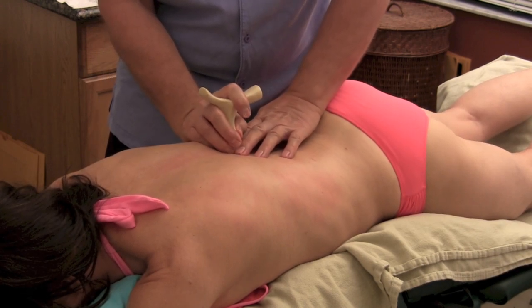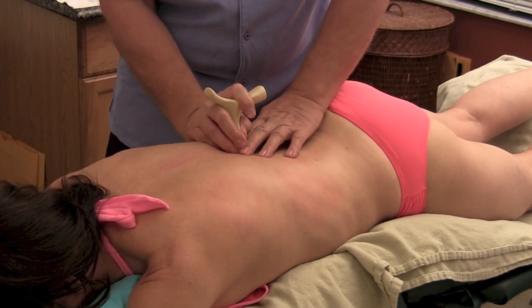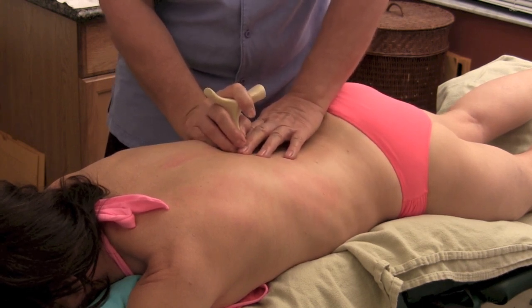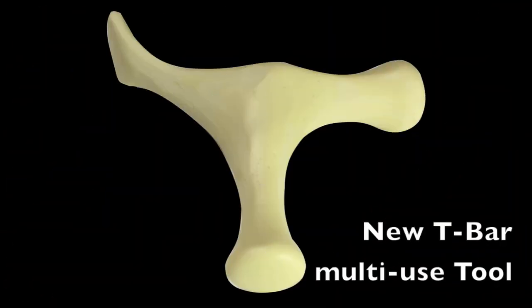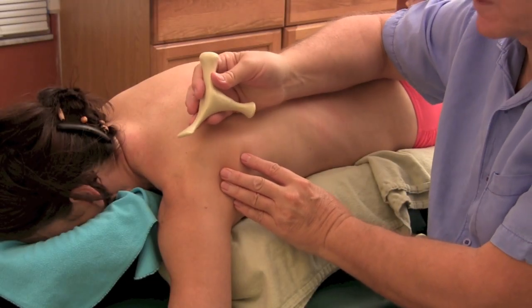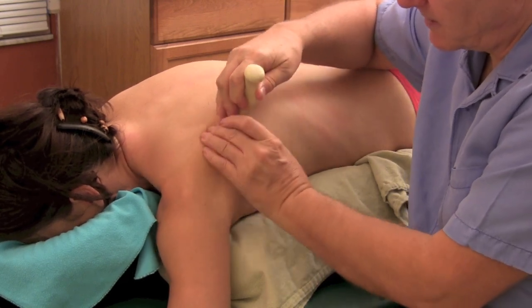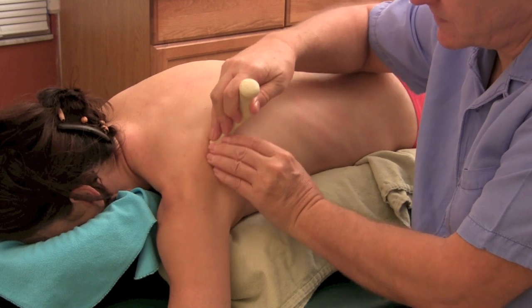Right there I feel a little speed bump, and I can hear a little vocalization from my patient as well. So I'm using the T-bar tool, using the flat edge and going right along the root of the scapula.